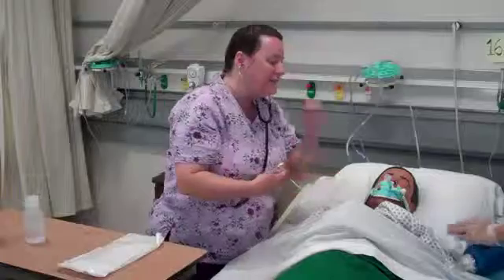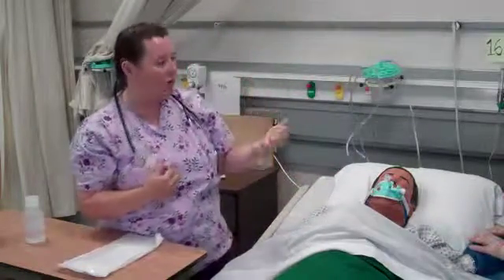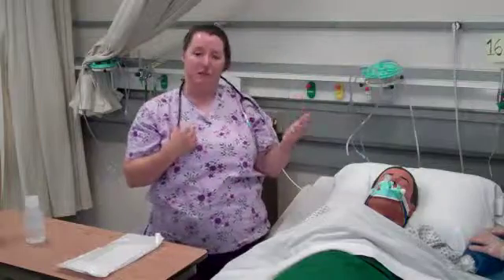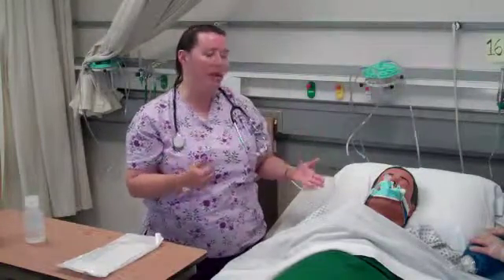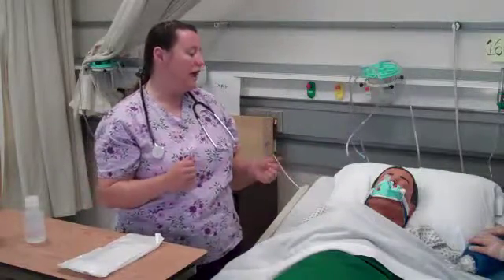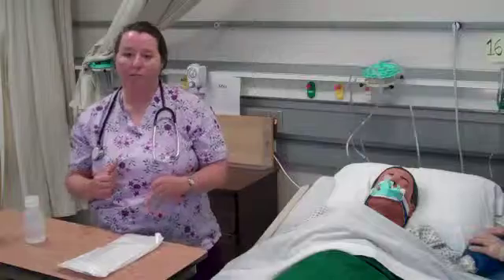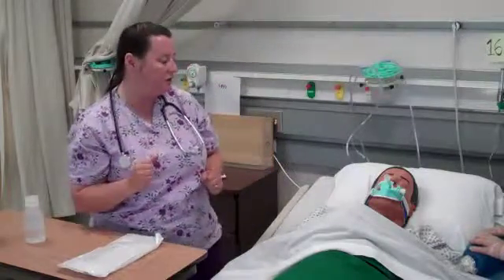And what I'm looking to see is if what I hear compares with what I might see on the monitor, like a low O2 sat, increased heart rate, increased respiratory rate. I might see the patient is a little bit more anxious, a little bit more moving about, showing some agitation. Condition would probably warrant it to be suctioned, and my doctor's order authorizes me to do that.